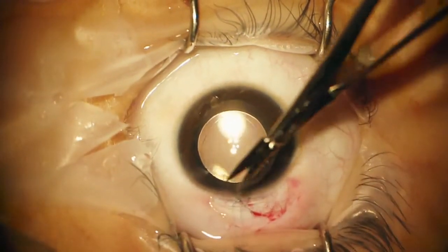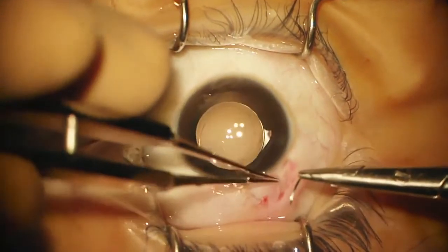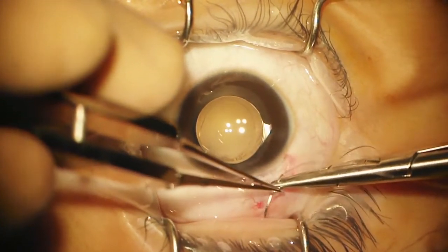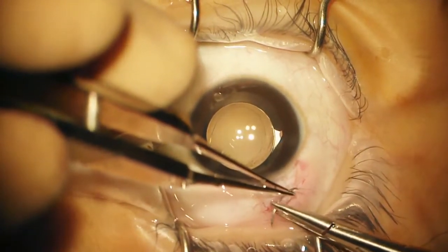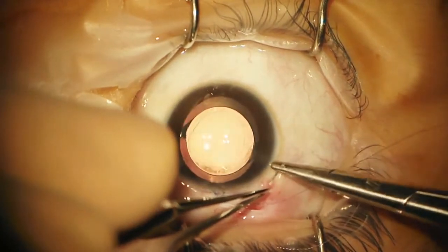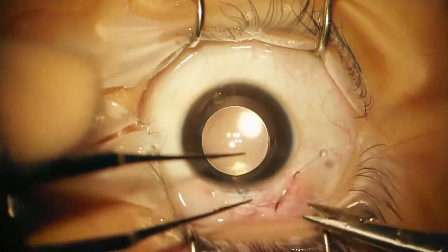I'll use one more Vicryl to close the conjunctiva. One question: why do you use two paracenteses? Because I was anticipating having to do bimanual I/A if needed, and that's why I always do two paracenteses — I anticipate I'm going to probably use it most often. But in this case it wasn't needed.